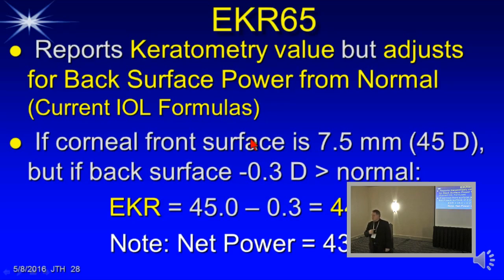If you use the EKR65 and you look down on your IOL calculations, it tells you what the residual astigmatism is. It highlights the one that it recommends, and then shows you what the refraction is going to be on that table. What I'm saying is you want to end up picking the lens that says you have a quarter of a diopter with the rule, which says it'll be plus a quarter, axis 90 degrees.